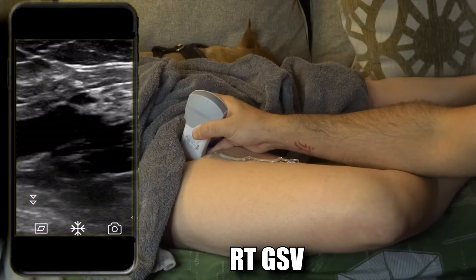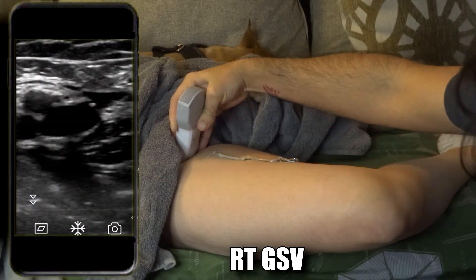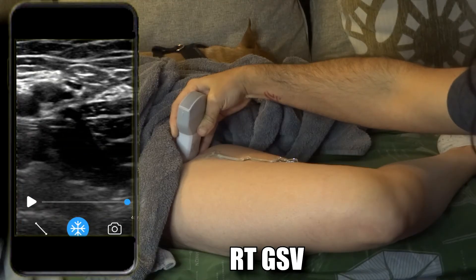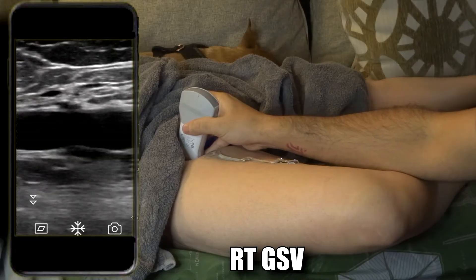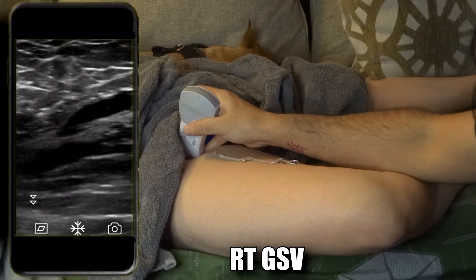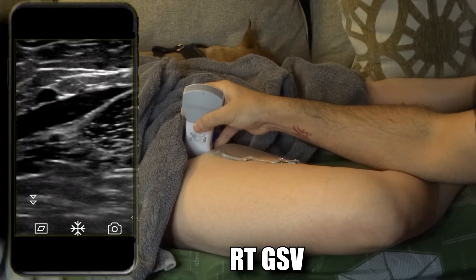Now onto the saphenofemoral junction. Go back and transverse — you can see the saphenous vein going into the common femoral vein. Take that picture, compress, take that picture. Then go sagittal and there's your saphenous right there, very clear, going superficial into the adipose tissue.